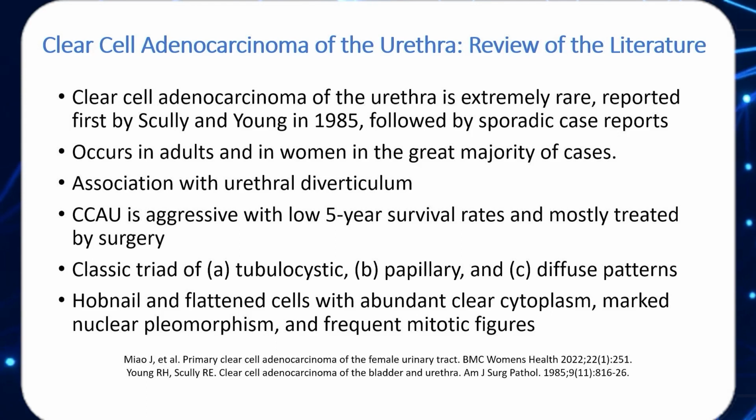So again, this is a real rare entity. And again, I just want to illustrate the fact that rare tumors can be encountered. I don't want to really propagate zebras to be found in urine samples on a daily basis, but just be aware that these are conditions that you may have to work with, that you may encounter unusual malignancies in your specimen samples. For this particular case, the example is fairly well illustrated. It's a classic triad, basically, of papillary configurations as well as hobnailing, and then accompanying with proteinaceous accumulation in the cytoplasm.